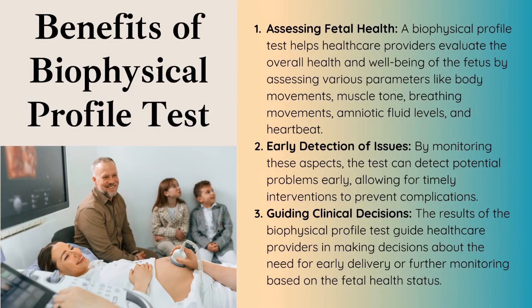Benefits of biophysical profile test. Assessing fetal health. A BPP test helps healthcare providers evaluate the overall health and well-being of the fetus by assessing various parameters like body movements, muscle tone, breathing movements, amniotic fluid levels, and heartbeat. Early detection. Issues can be detected early, allowing for timely interventions to prevent complications. Guiding clinical decisions. The results of the biophysical profile test guide healthcare providers in making decisions about the need for early delivery or further monitoring based on the fetal health status.